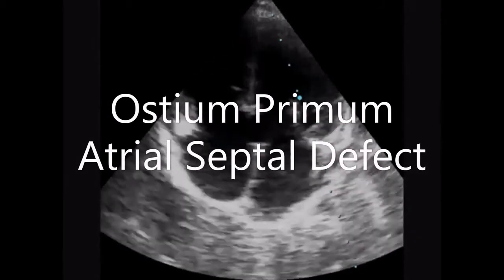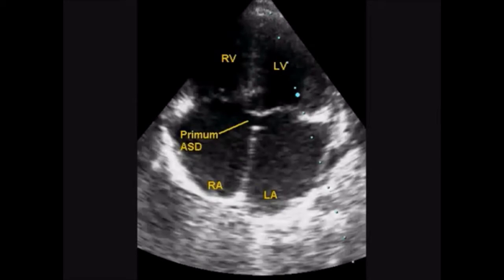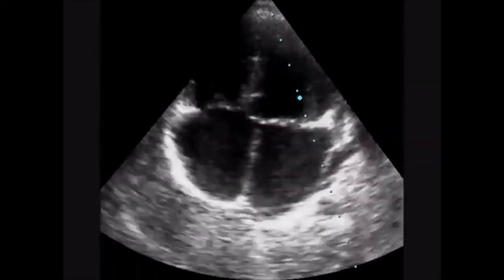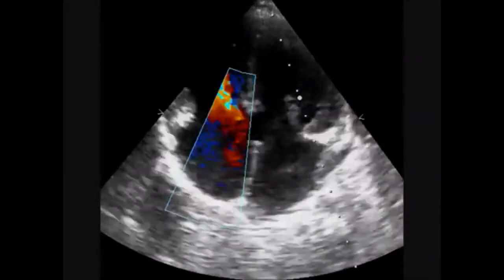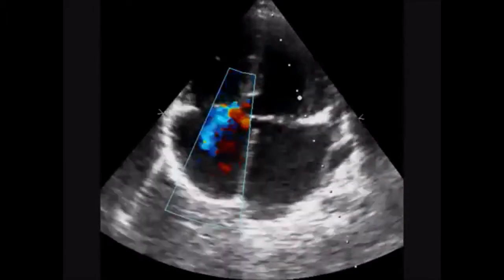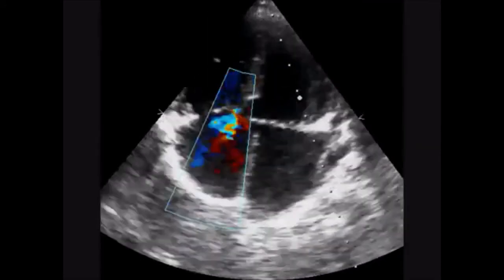This is the echocardiogram in apical four-chamber view showing an ostium primum atrial septal defect. Left to right shunt across the atrial septal defect is seen. Atrioventricular valves are at the same level. Here you can see the tricuspid regurgitation jet in the apical four-chamber view.